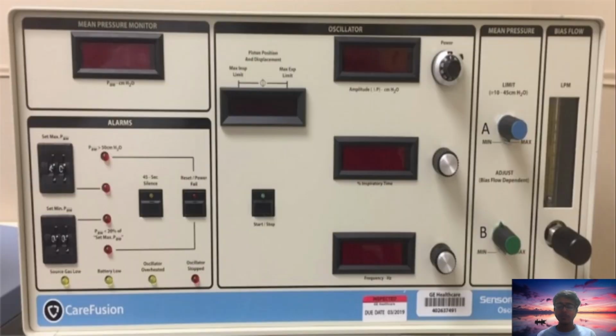So this is one of the HFOV machines. It's an older machine. Here you can see a mean pressure monitor. Here is the amplitude, this is the inspiratory time, and this is the frequency. Here they will adjust the mean airway pressure, and this is the bias flow. In this they will adjust the oxygenation flow and all the alarms.